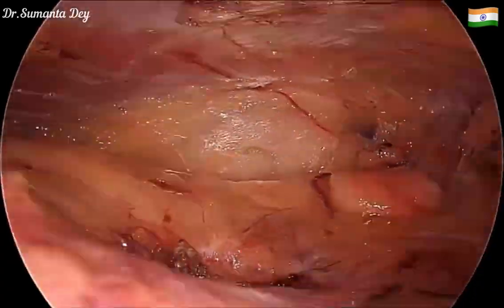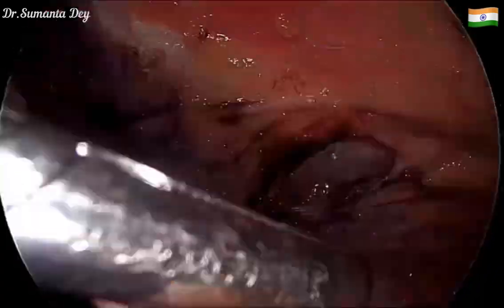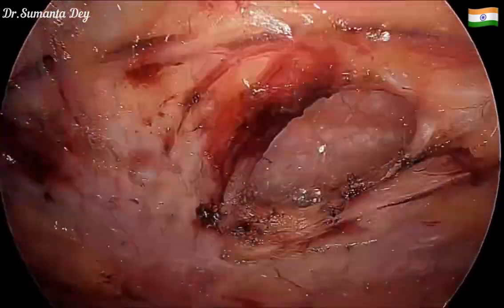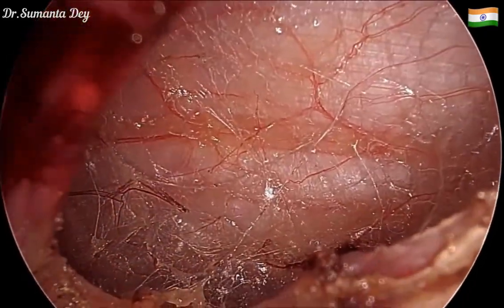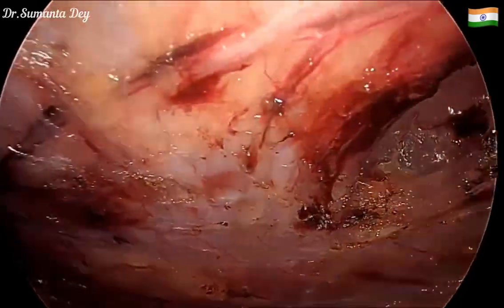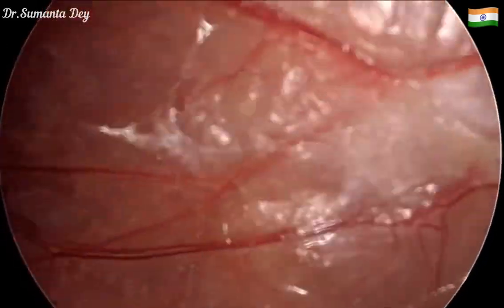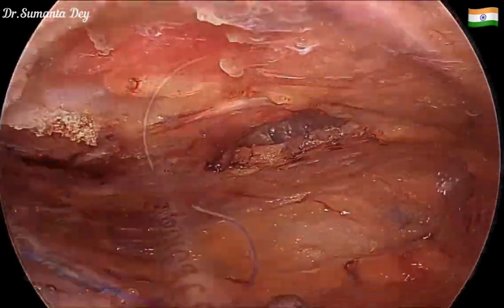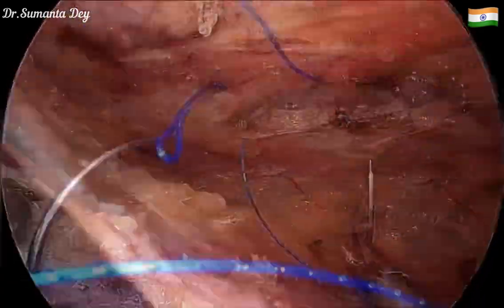This is the defect — you can see this is the interparietal hernia. The internal oblique and transversus abdominis muscles form the defect surrounding, and the roof of the defect is actually formed by the external oblique aponeurosis.